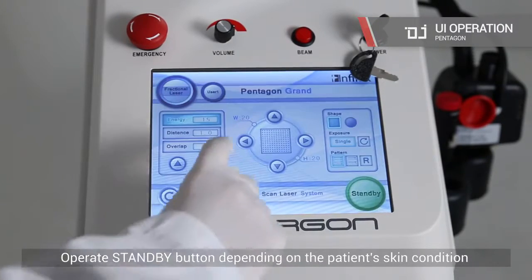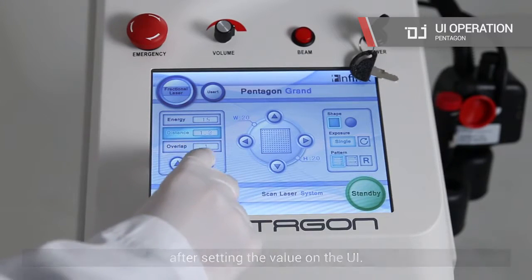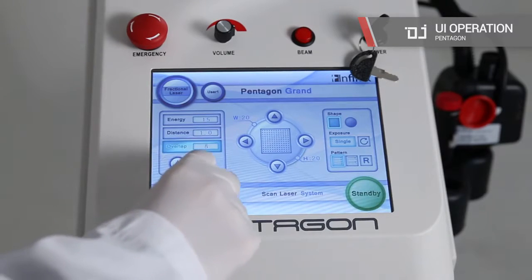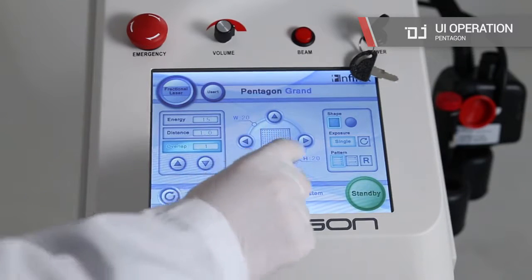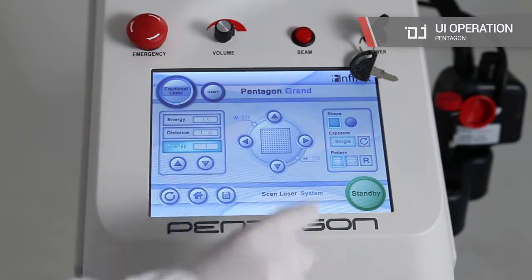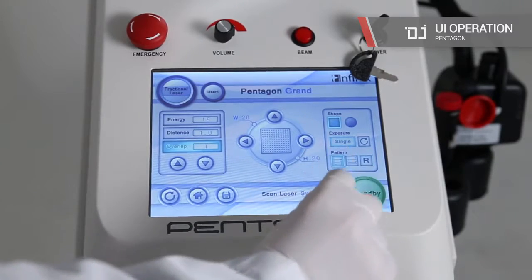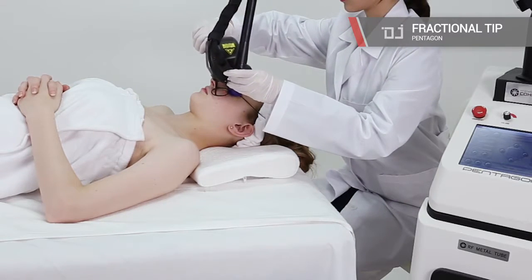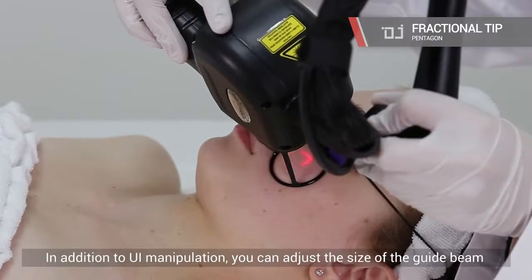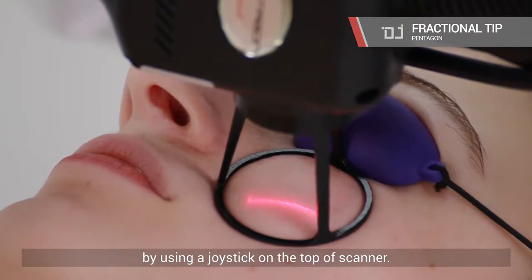Operate the standby button depending on the patient's skin condition after setting the value on the UI. In addition to UI manipulation, you can adjust the settings. You can adjust the size of the guide beam by using a joystick on the top of the scanner.